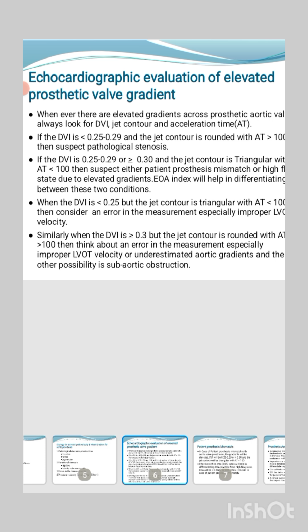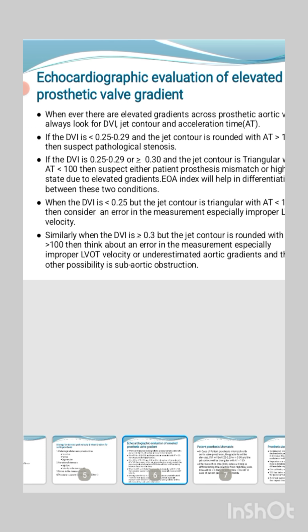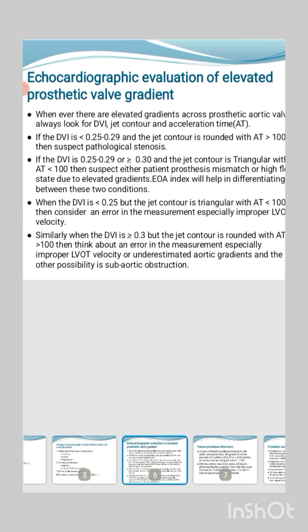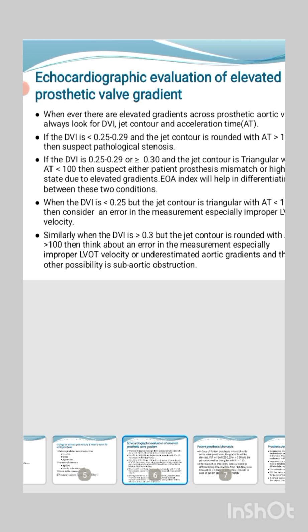If the DVI is 0.25 to 0.29 or greater than 0.30 and the jet contour is triangular with acceleration time less than 100, then suspect either patient prosthesis mismatch or a high flow state due to elevated gradients. Effective orifice index will help in differentiating between these two conditions.